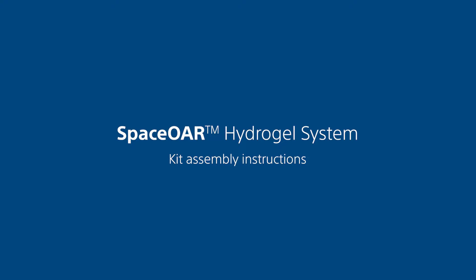This instructional video demonstrates how to prepare the precursor syringe in the SpaceOr Hydrogel Kit using the vial adapter. Identify the marked needle hub to facilitate correct orientation of the needle during the procedure. Refer to the product's directions for use for details on the kit assembly and the procedure.